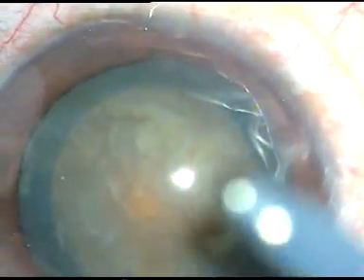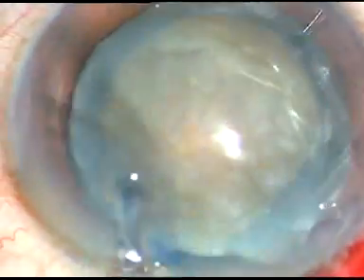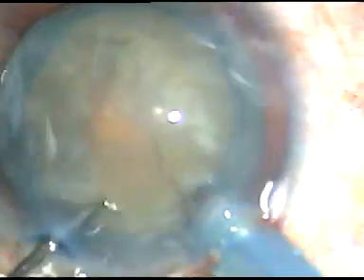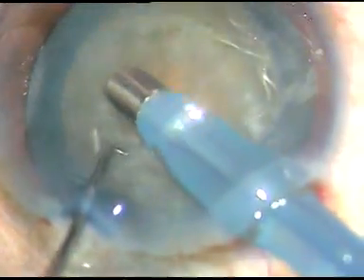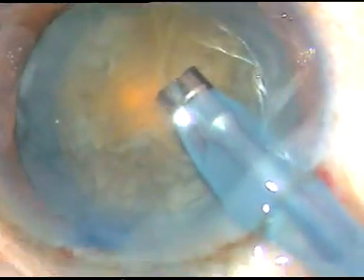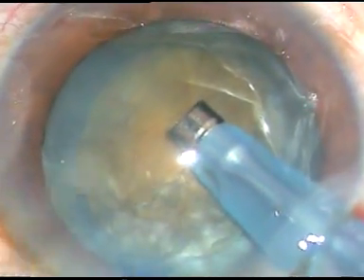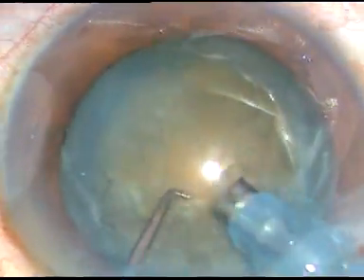This is the Oatley Catarix-3 phacoemulsification machine. Irrigation is on. Bevel down — aspirate some superficial cortical lens matter. Turn, make the bevel up. And now in this case I am going to do direct vertical chop.